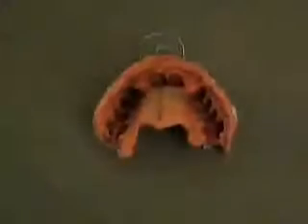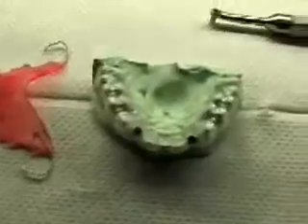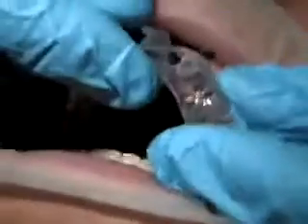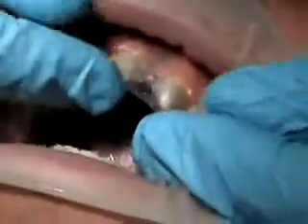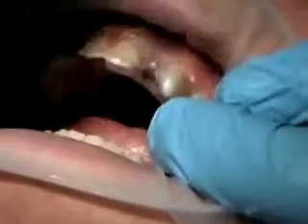In a previous appointment with Ben, we took a Panorex x-ray and made a rubber impression which we sent off to the lab. The lab fabricated a surgical stent on a model of Ben's mouth, including titanium guiding sleeves. These sleeves will guide the drill to ensure accuracy in placing the pilot hole. Before you begin, make sure you have a good tight fit with the stent — make sure it's stable, with support on two sides from his teeth.